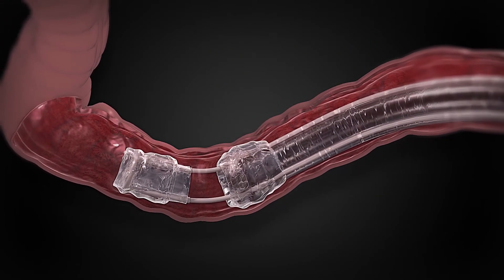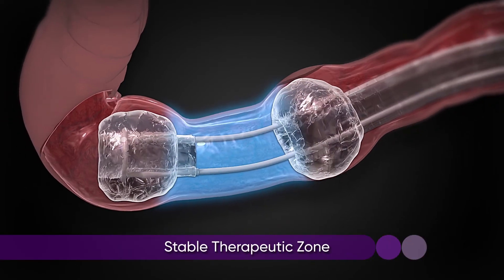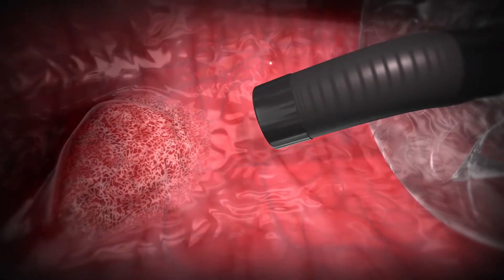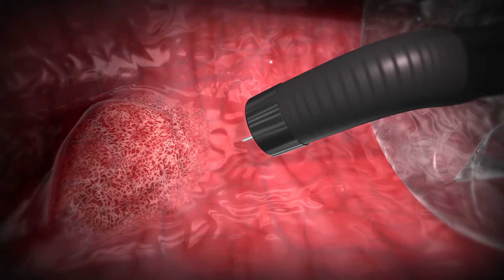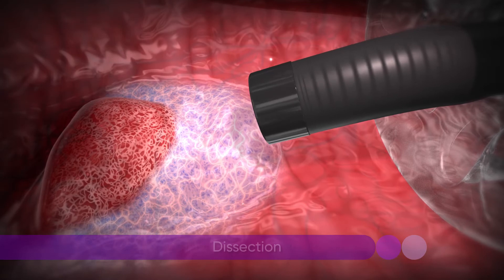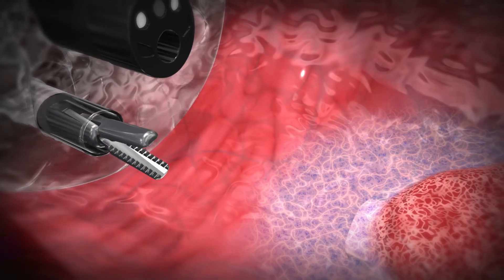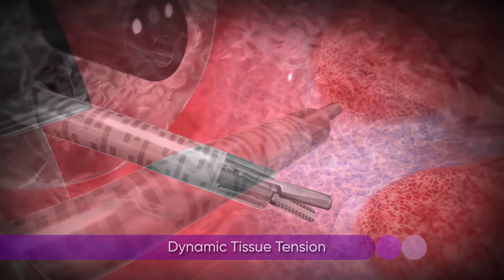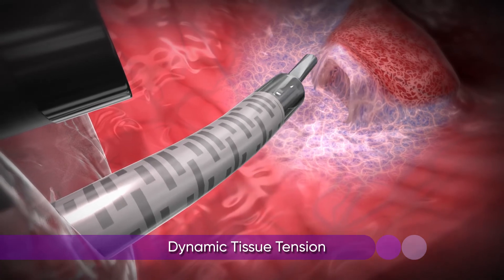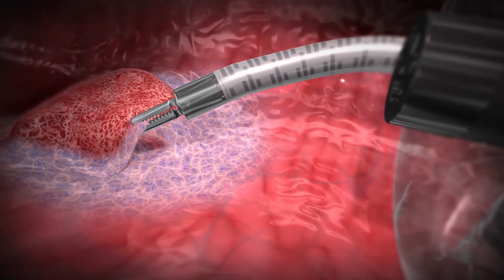In the treatment of complex polyps, the DiLumen C2 is positioned and the balloons are inflated to create a stable therapeutic zone. Standard submucosal injection is employed to lift the polyp. DiLumen instruments are then used to facilitate a controlled manipulation and dissection of mucosal and submucosal tissue. The DiLumen IG provides dynamic tissue tension as it can grasp and re-grasp tissue and retract in multiple directions, which provides improved exposure for controlled dissection.